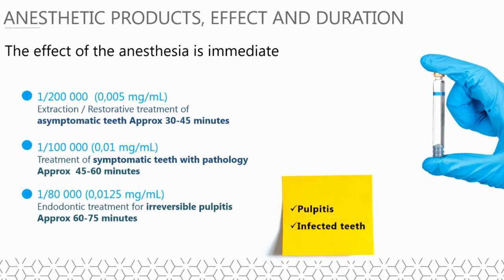The second is the type of anesthetic product. Any type of anesthetic molecule can be used, but the most common and effective in most countries are articaine or lidocaine. The use of adrenaline is recommended to increase the effectiveness and reduce the systemic toxicity of the anesthetic.